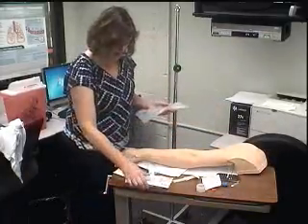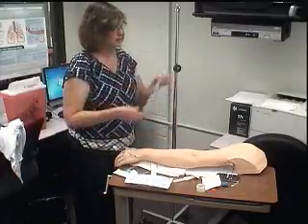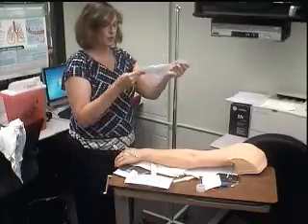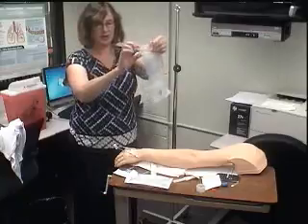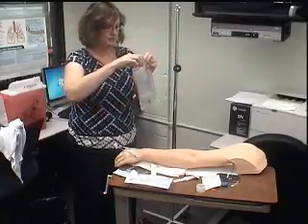This is just like you guys did before. So I check my fluids, you know, I've done my 3 checks on my 11 rights, and I'm going to go ahead and open up my bag of fluids. Usually there's a little notch where you can tear. Don't take a scissors to this, you can cut the bag. So open this up.